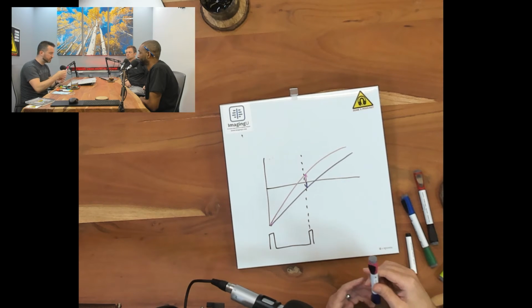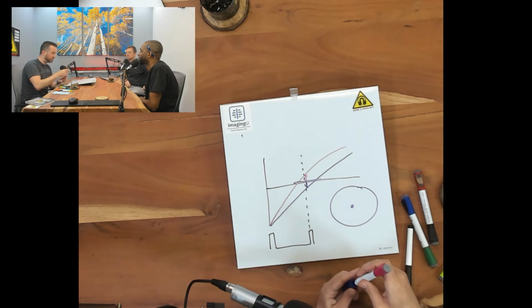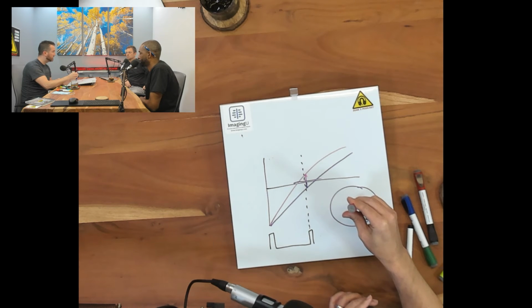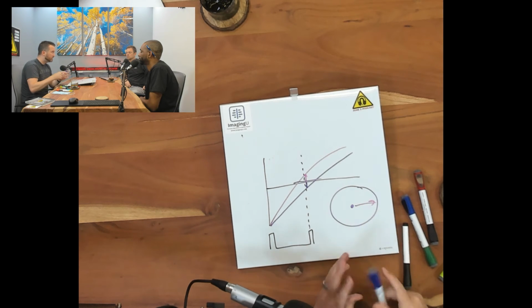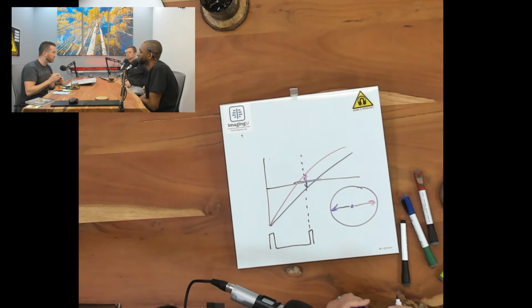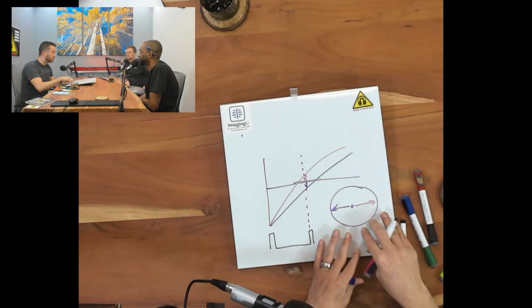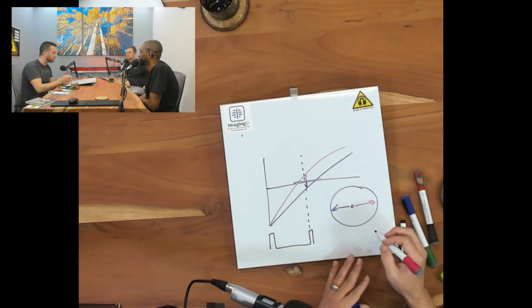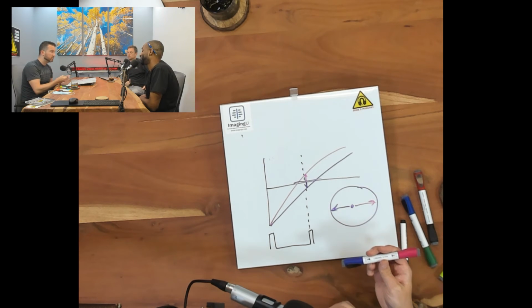But what happens here, and in this analogy, this is perfect, actually. With a phase-sensitive inversion recovery, let's just look on this plane, so you're looking straight down. Right now these are aligned just like this. But as soon as I put in the 90-degree pulse, they're going to be facing in different directions inside the transverse plane. That's the reason, in cardiac, you do delayed myocardial enhancement, and if your inversion time is off, then PSIR, the phase sensitive, is going to be your mechanism. What manufacturers will do is say, if you have a positive change in phase, if you're pointing this way, we'll give you a bright pixel, and if you are pointing this way, we'll give you a dark pixel. So you have an additional mechanism for contrast if we're being sensitive to phase inside the transverse plane. Hence phase sensitivity.